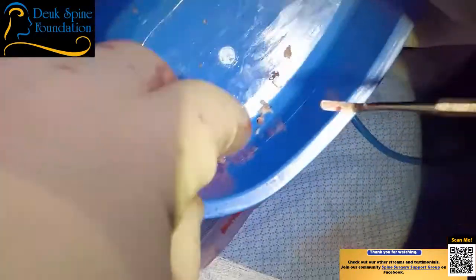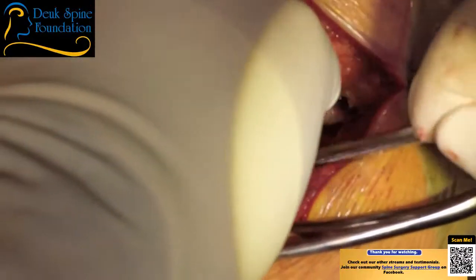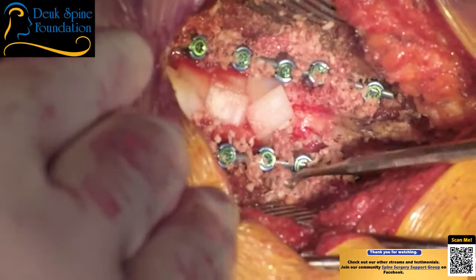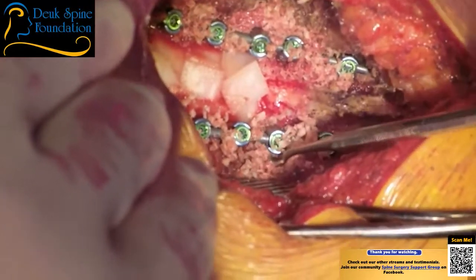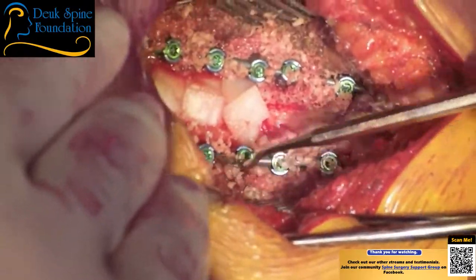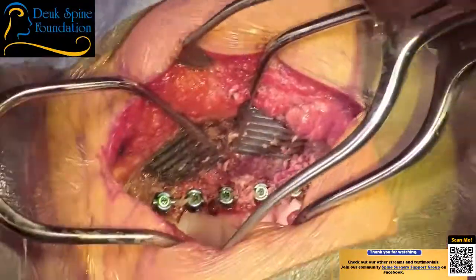All right, we're almost done with our grafting. That is our last step before closing. We've already tightened all the metal screws. We've already done our decompression, and now we are going to close up. Sir, we're closing. We'll be closed in about 15 minutes.